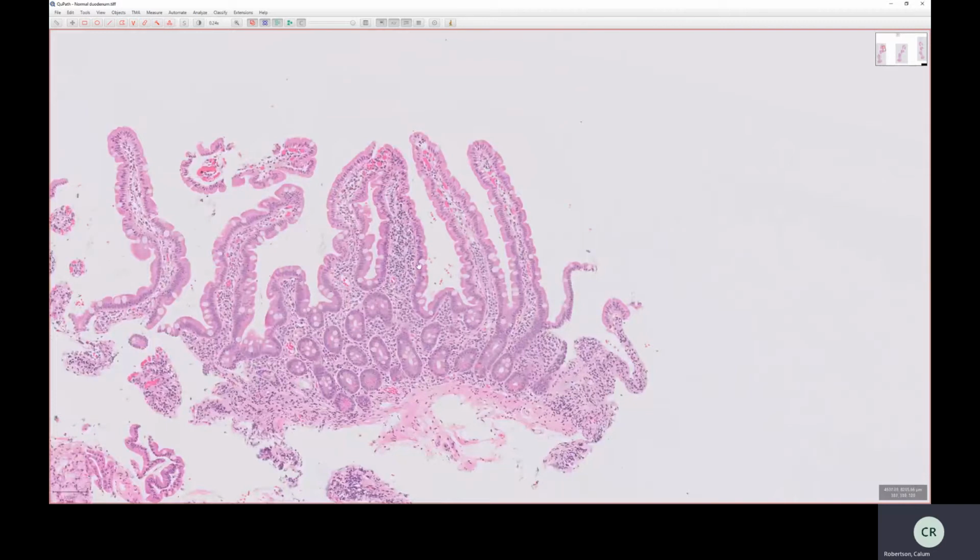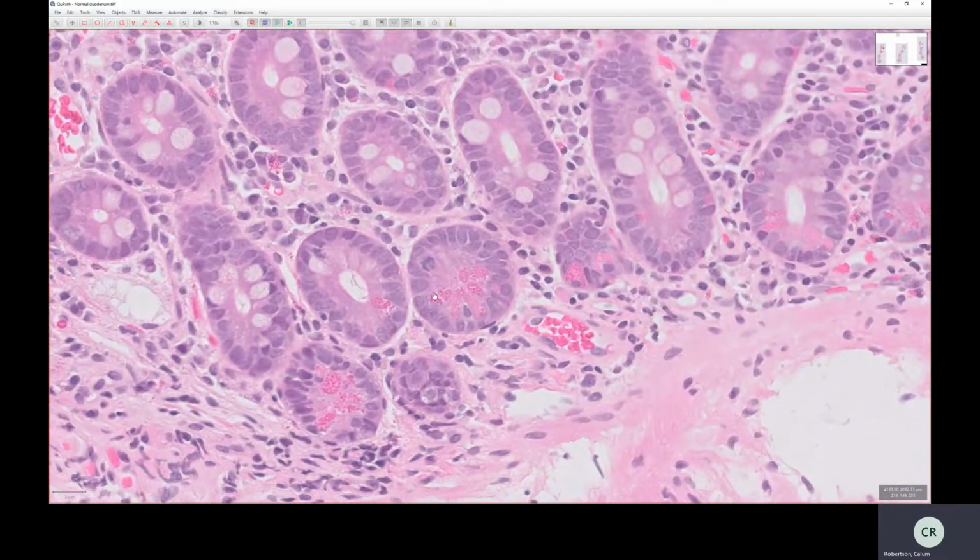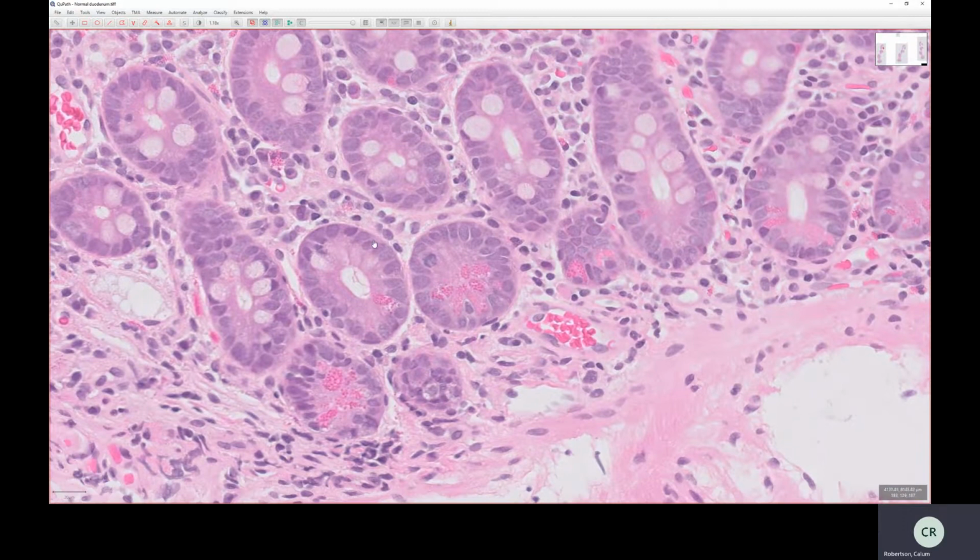So we've got absorptive cells, we've got our goblet cells, which are doing the secreting, and right at the base here, there's another couple of different types of cells. So we can see interspersed among these other ones, there are these cells with these pink granules. This is a cell with a basally located nucleus, and above that are these pink granules. So this cell is known as a Paneth cell.